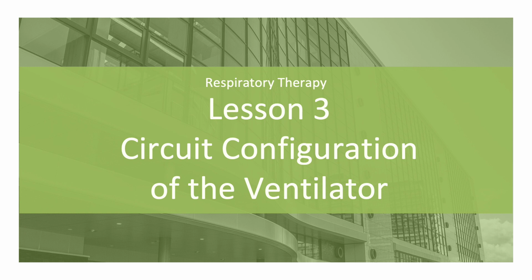Respiratory therapy, Lesson 3, Circuit configuration of the ventilator. This unit will cover the basics of respiratory therapy.